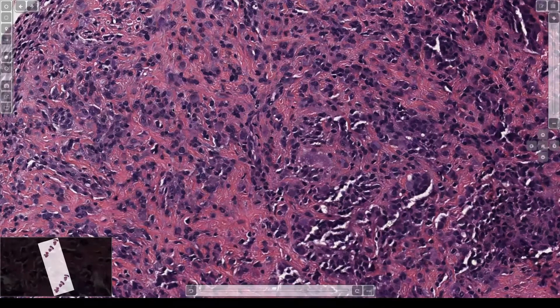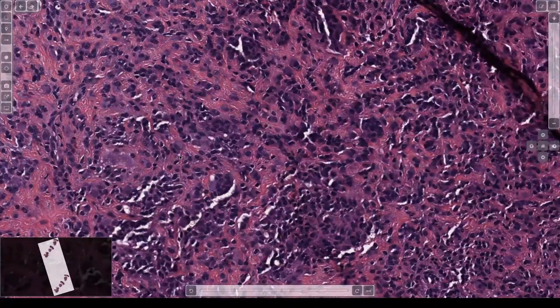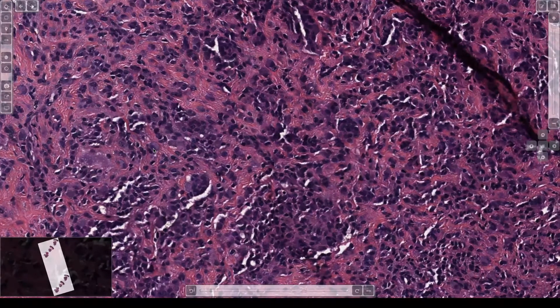The actual cells of the tumor are these. They're histiocytoid cells and they usually have abundant pink cytoplasm and an eccentric nucleus. It almost looks like a plasmacytoid or even rhabdoid cell where it's got a pink blob of cytoplasm pushing the nucleus out to the side.